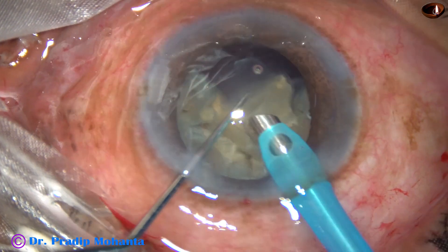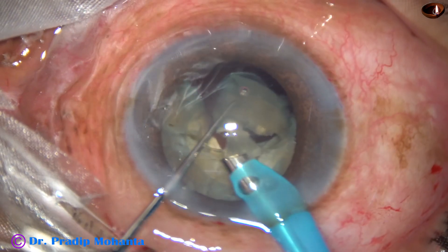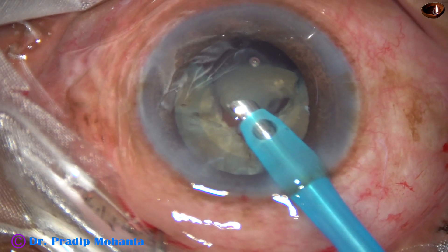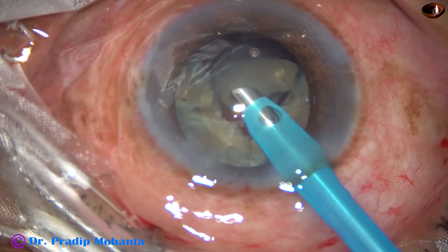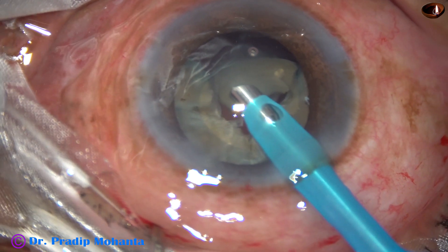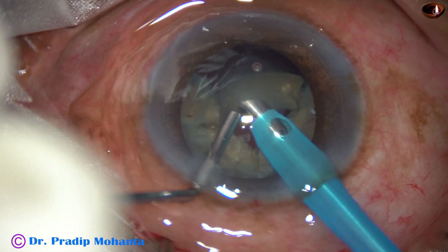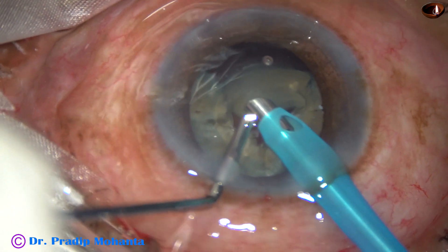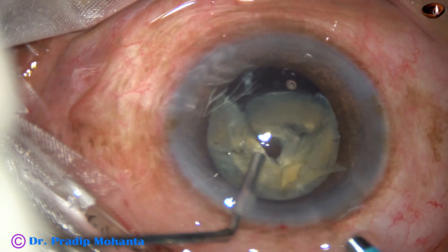Still, it is on the posterior part of the bag. But if I don't take care at this stage, it is going to be a disaster. So I pause for a while, think about what to do, and then decide to come out. I hold the base of the Visco cannula and ask my assistant to inject Visco, stop irrigation, and I come out.